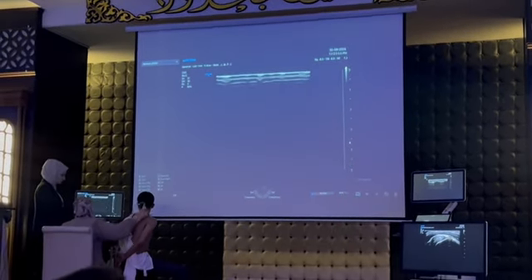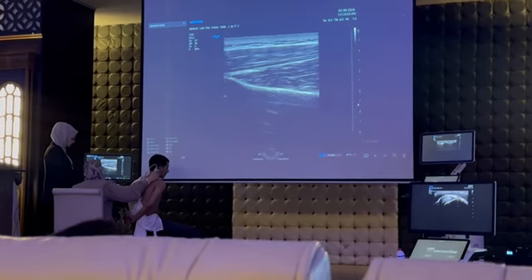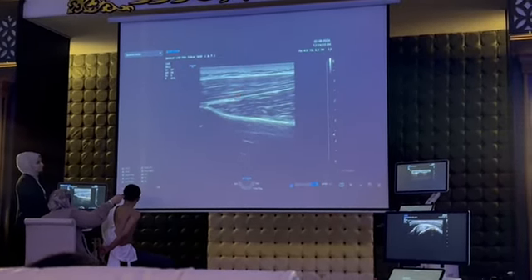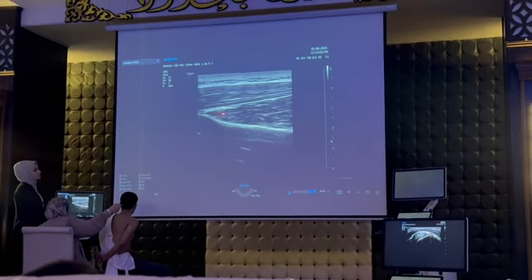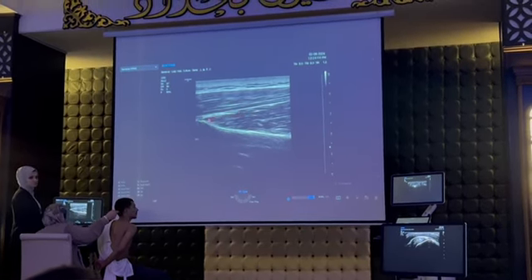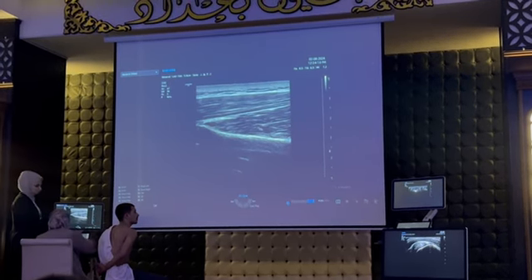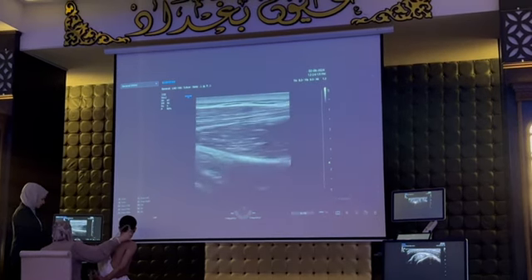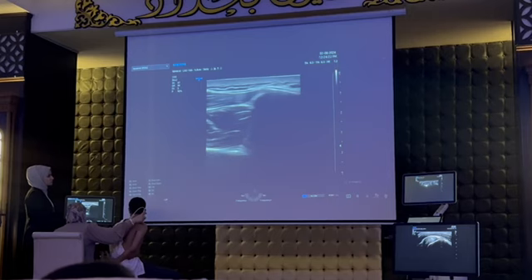So now return back for examination of supraspinatus from medial to lateral. Palpate the scapula, it is just above the scapula. You see? The first muscle is the trapezius muscle. Below it, which is fish-like appearance, this is the supraspinatus. From medial to lateral, you see the increased thickness of it. So continue to examine laterally until reaching the defect. This is the defect. You see?